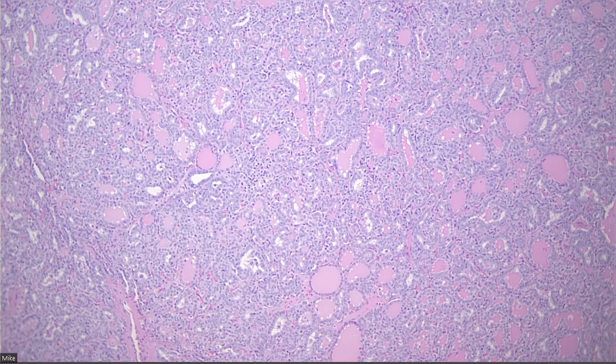If you look at the BRAF fusion line, all of these little tick marks sort on the BRAF-like side of the bar. I was like, well, it doesn't really look like classic PTC to me, but they've told me that the gene expression profile of the BRAF-fused tumors is more like a classic PTC. So I can't ignore that. I have to go back and revise the report and call this a classic PTC with unusual morphologic features.